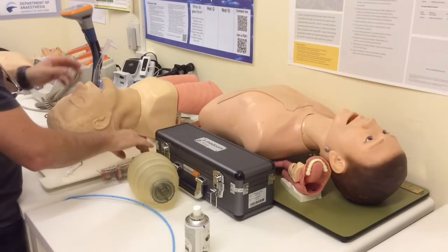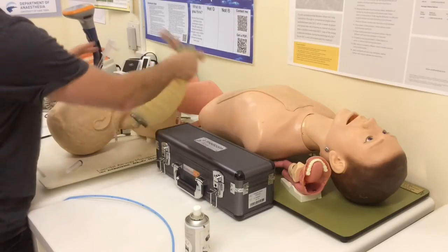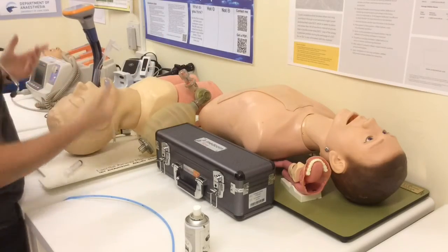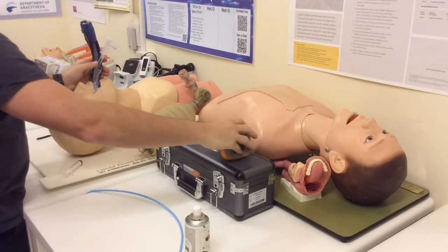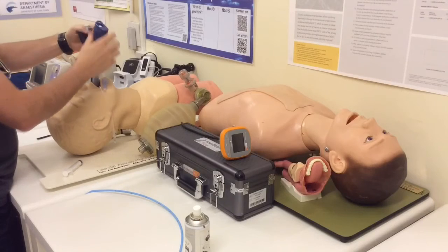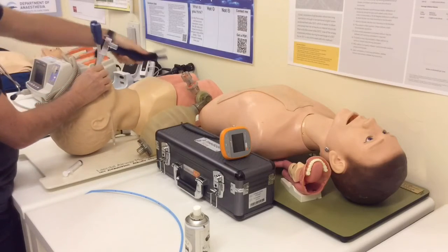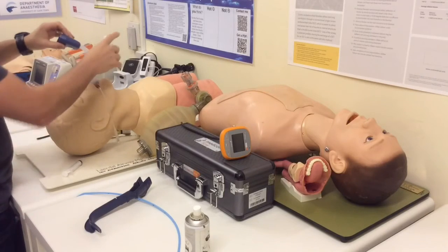Okay, so you said to me, well, fine. Now your patient's intubated, they're connected to the ventilator, they're being ventilated. I'll leave that out of the way for the meantime. But this looks really bulky and inconvenient. Well, it all comes apart. So, camera head comes off once I'm happy with the positioning. This rigid introducer peels off like this, and following the curvature of the airway, I can take it out. And now I'm just left with a soft LMA stem and the endotracheal tube in place.